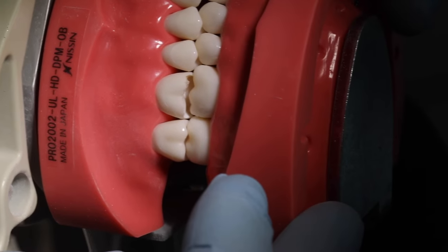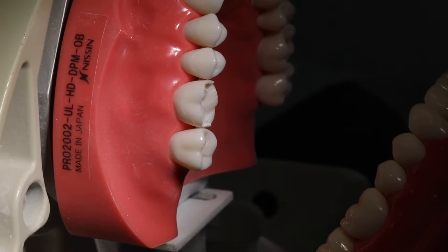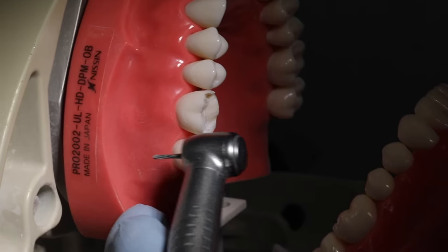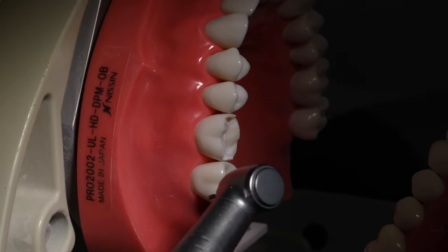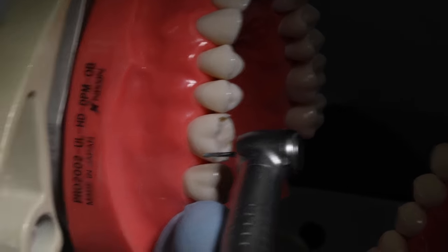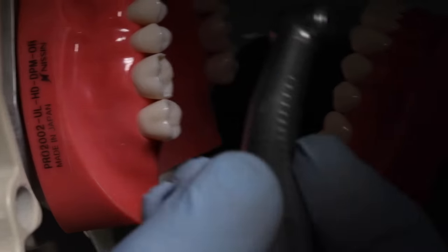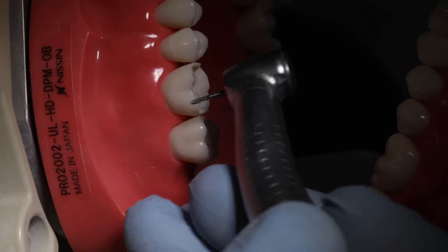We can now move to breaking contact, and so we'll stay with our 1557 burr and move now to the distal proximal contact. Again, I recommend that you always do these in direct vision. It's a lot easier than trying to do it through a mirror. So have the patient turn way off to the left so we can see directly through that proximal contact. Pull their cheek back out of the way, and it makes it a lot easier for you, and you do a little bit better job.